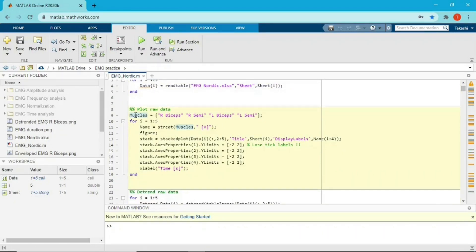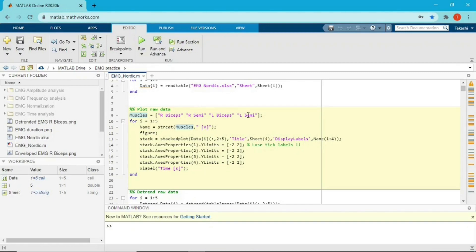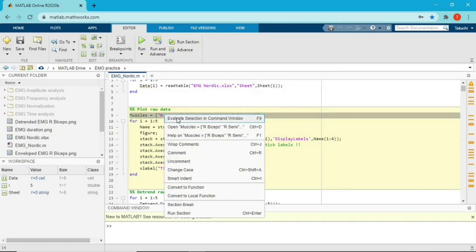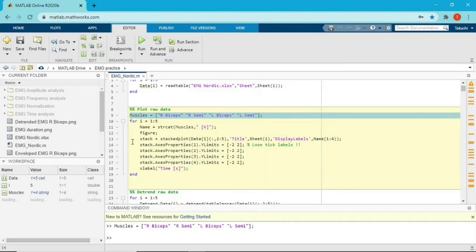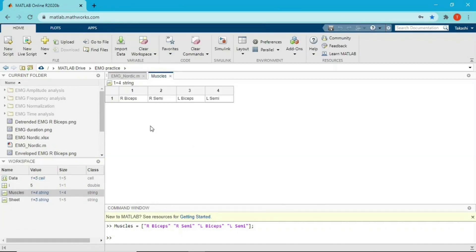So the first line is just the name of the variables. I created the variable called muscles and the name of muscles right here: right bicep femoris, right semimembranosus, left bicep femoris, and left semimembranosus. If I run this, I create a variable called muscles right here. So I just created a name, nothing else.